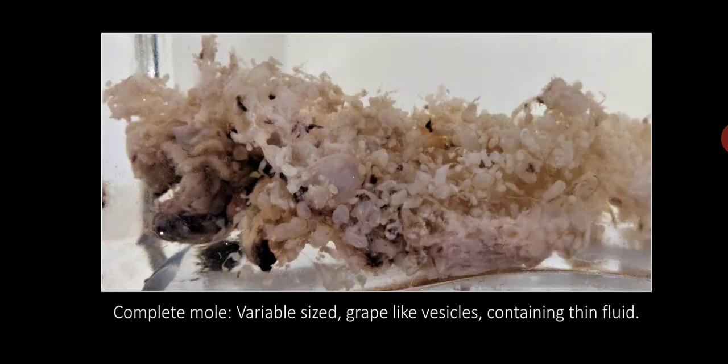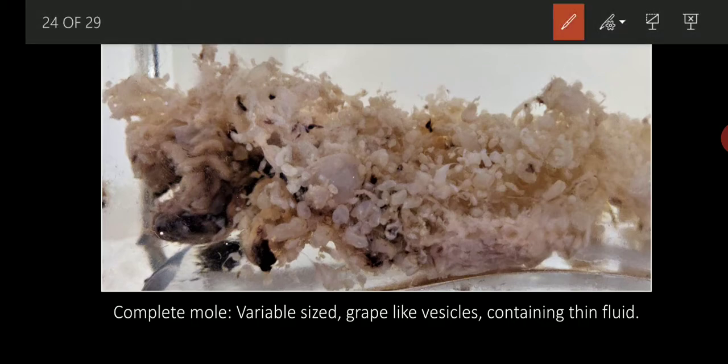This is one of our museum mounted specimen. The uterus was not removed in this case, only the contents of the uterus was removed. Hence what you see here are a bunch of grape like structures. The hydatidiform mole are usually swollen up or show hydropic degeneration of the chorionic villi. When they swell up, they appear like grapes, grape like structure. They are thin walled vesicles, and when you cut them, they will contain thin fluidy material.